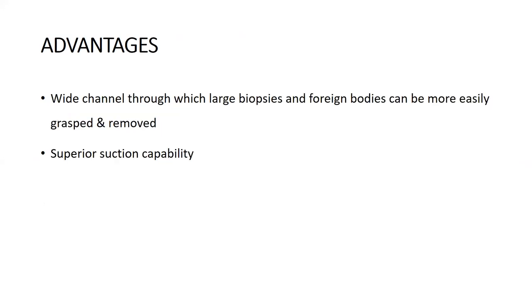The main advantage of the rigid bronchoscope is that it has a wider channel, so that we are able to get larger biopsies, foreign bodies can be easily grasped and removed, and it has a superior suction capability.